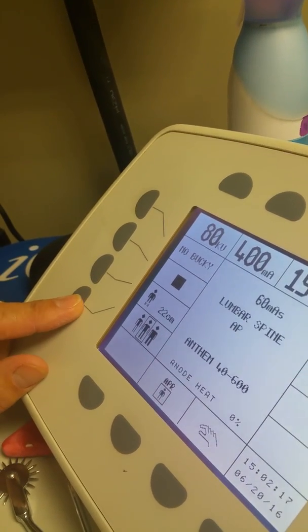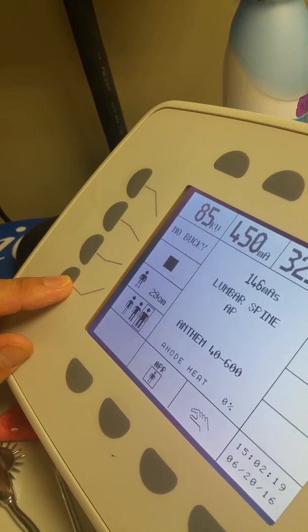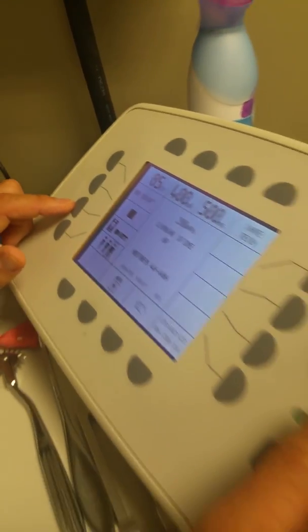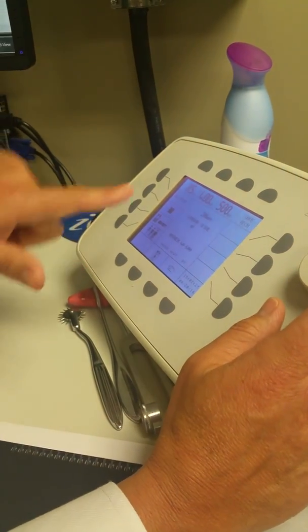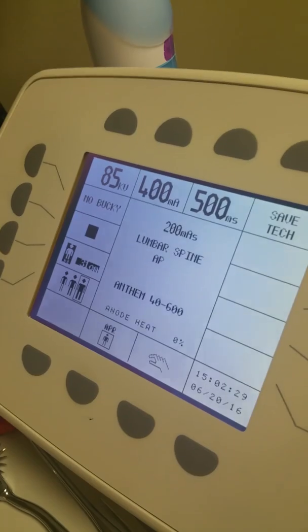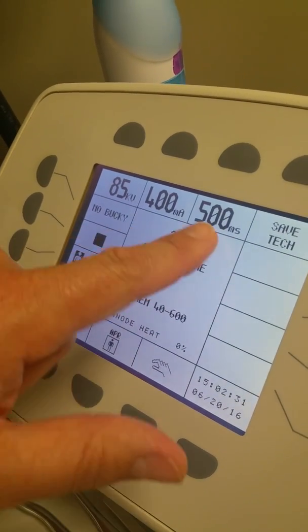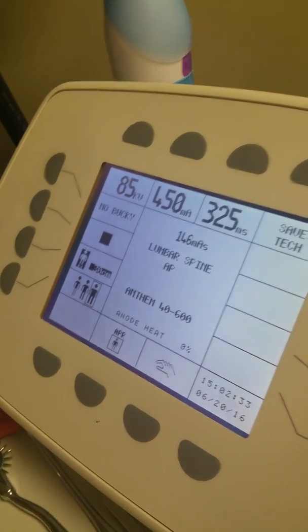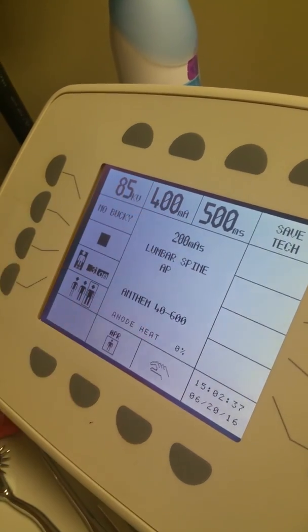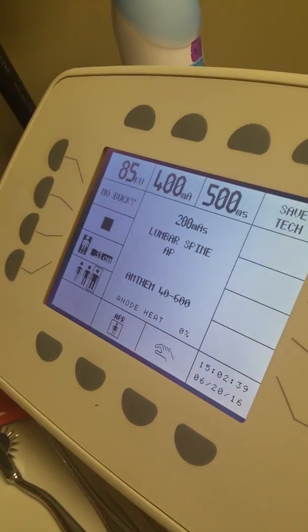We'll come back down to the body type, again, large males. So we're going to set them up there. Again, we're going to adjust the centimeters as high as we can on this individual. If you can zoom in on this too. If you notice, when you adjust the centimeters, you also see the parameters up top adjust for that. So we'll set it at the highest, and then if you think you still need to tweak it, you can do it a little bit more up there.